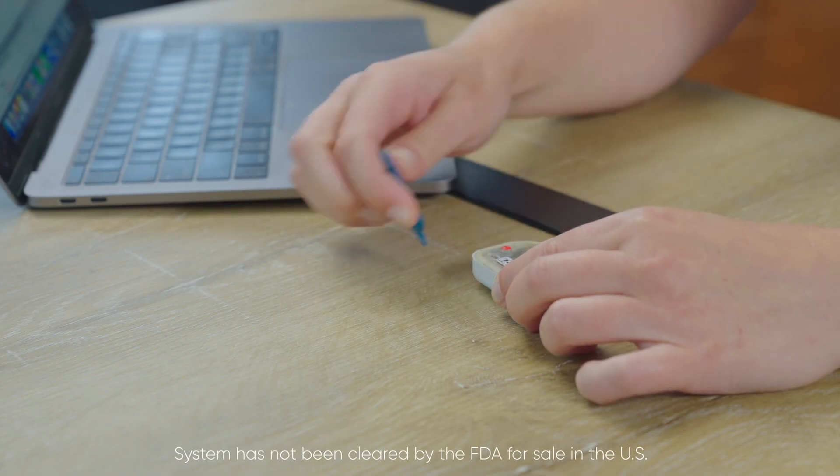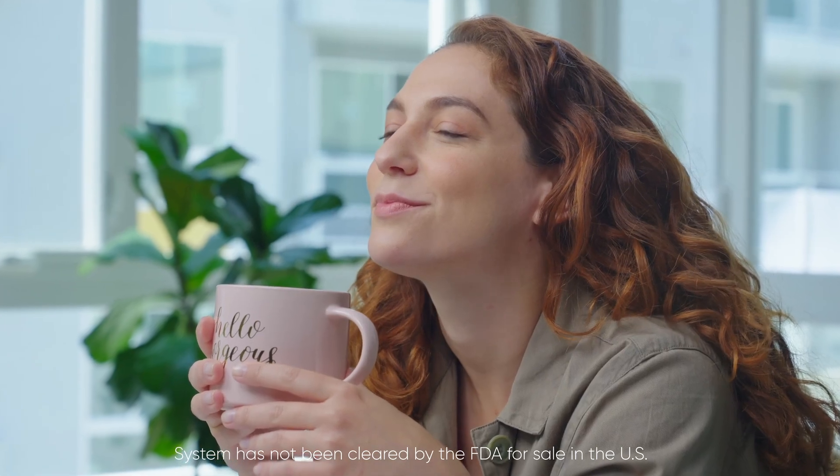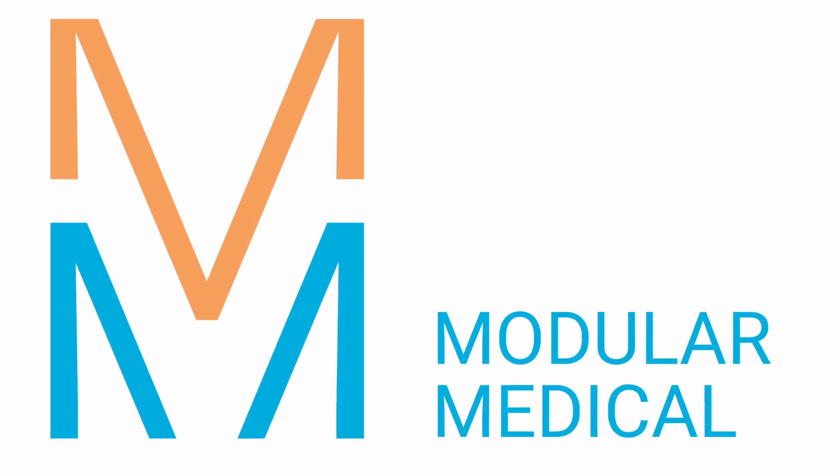You may also remove the pump, and if your cartridge is empty, release it from the pump using the same priming tool. At Modular Medical, we are developing technology to achieve better health outcomes. Thank you.